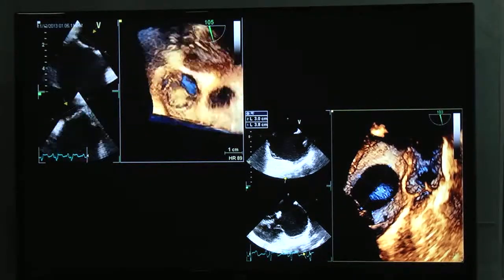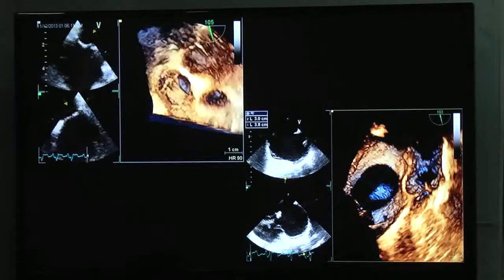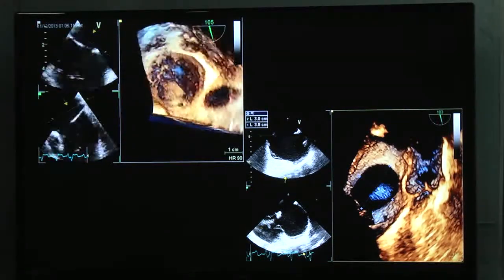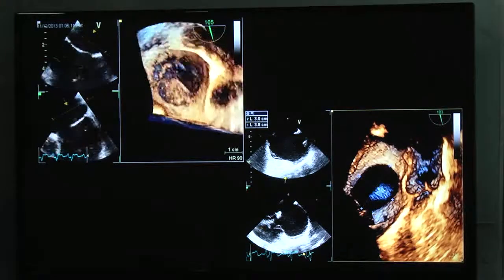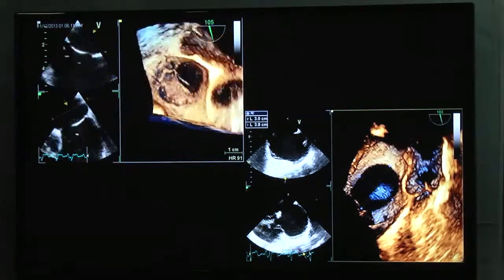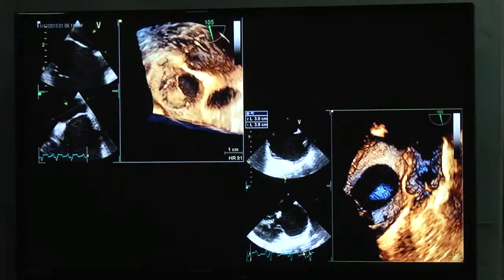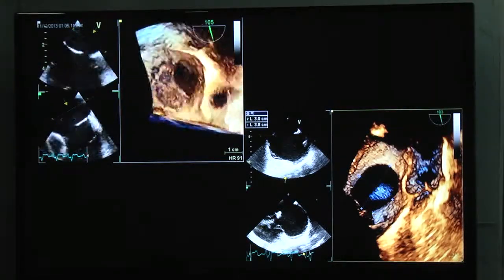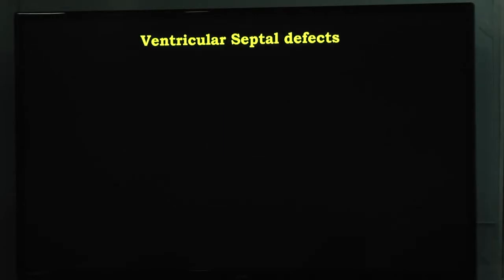These are the only ones I regularly use TE at present. Very important, so that I go through the main defect. And if you have gone through the main defect, we did one 2 days ago as well, then it is much easier. Without TE, we couldn't do that ASD otherwise. Ventricular septal defect, similar.